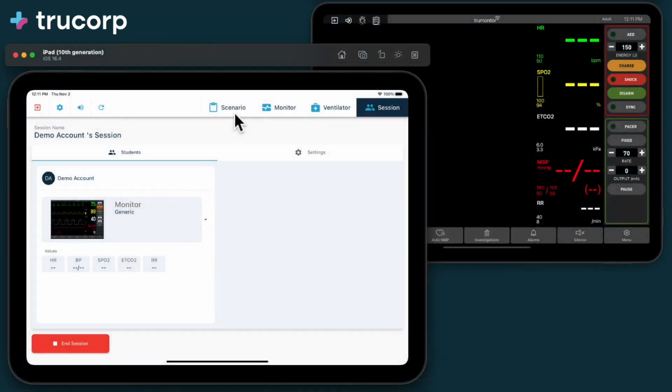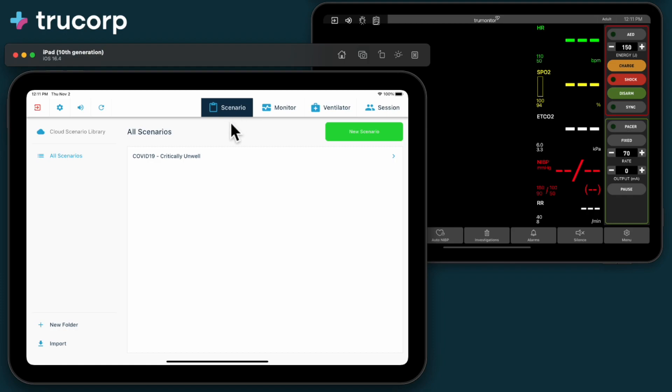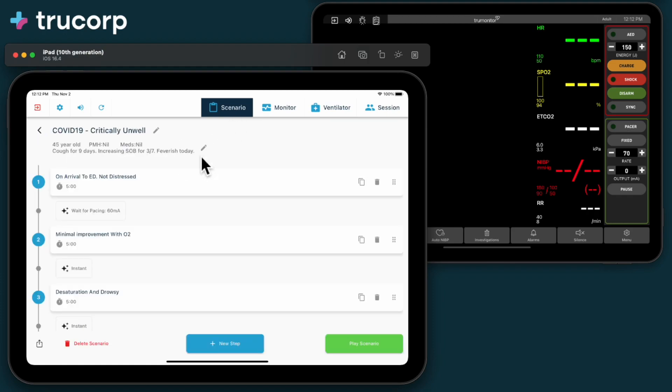To play a scenario during a session, select the Scenario tab on the Instructor panel. Select your Scenario, and press Play Scenario.